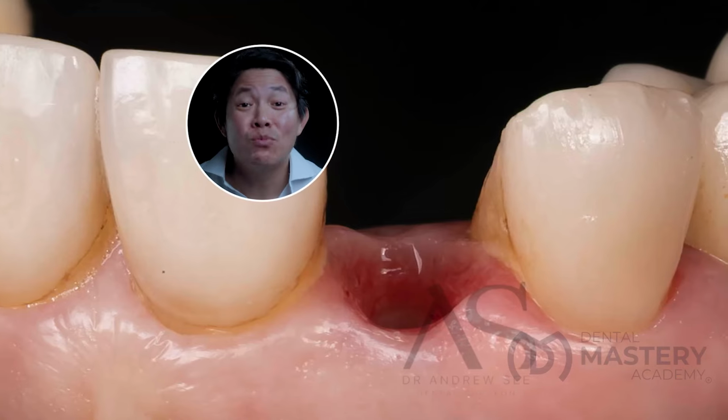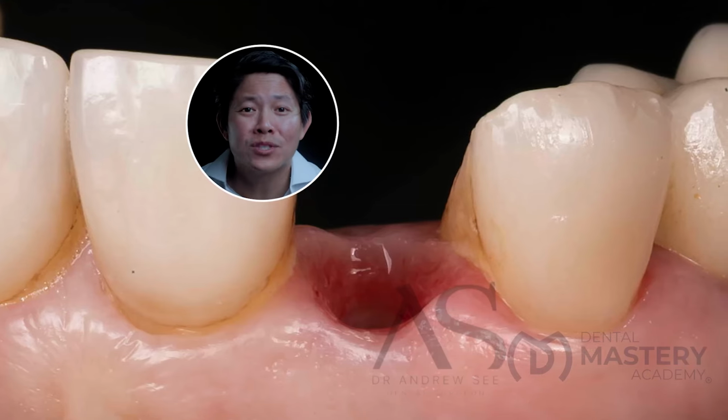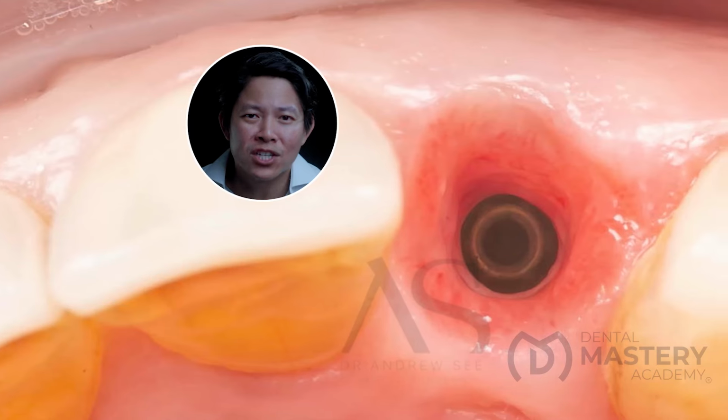After 5 to 6 months, it's ready to be restored. You can see a wonderfully developed emergence profile which resembles the original situation. This patient is an older patient and has some previous gingival recession present before.